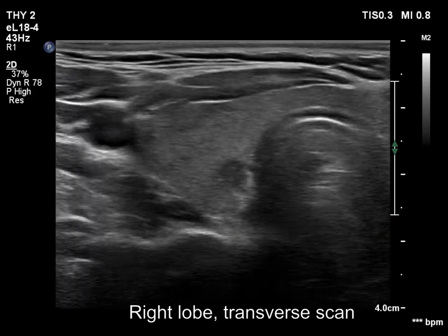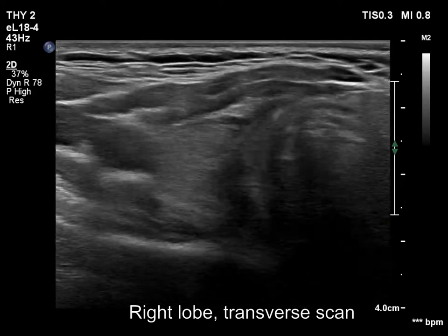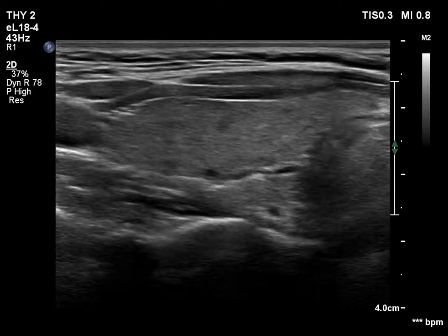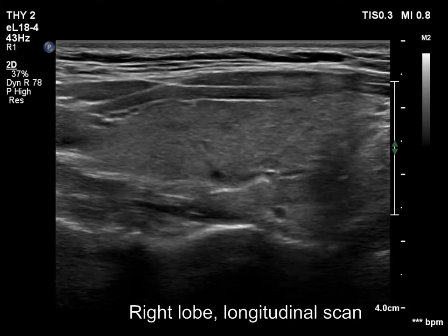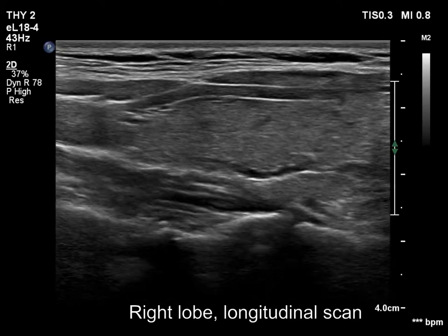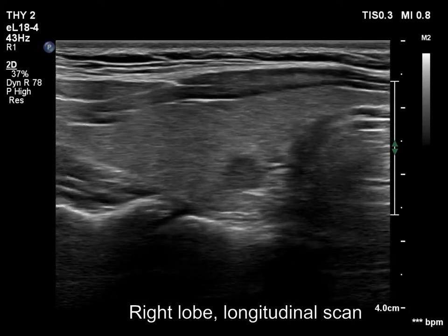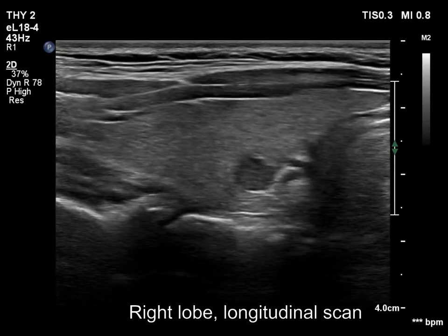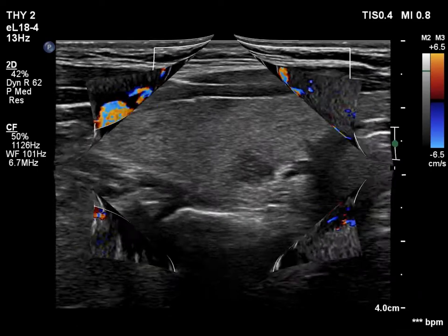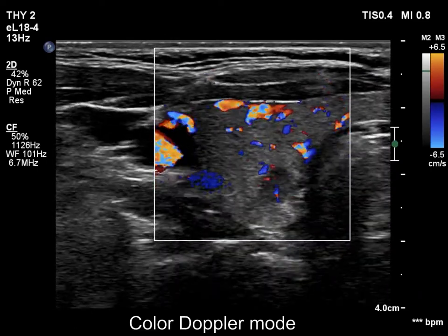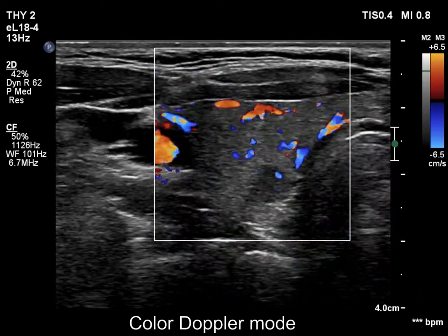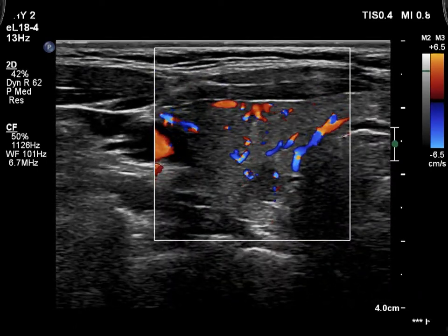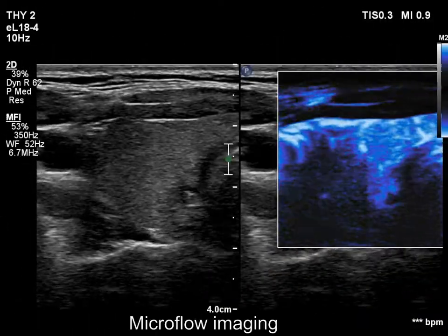The right lobe is echonormal and has an isochoic and a moderately hypochoic discrete lesion. The vascularity of the lobe is a bit increased.